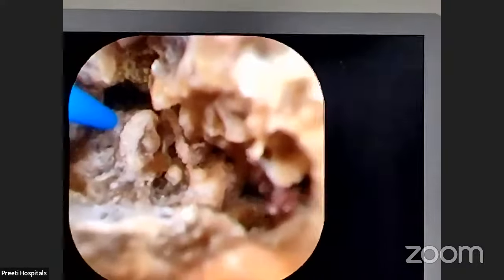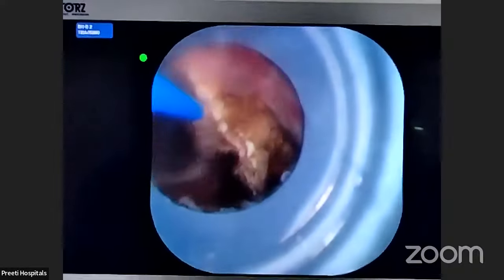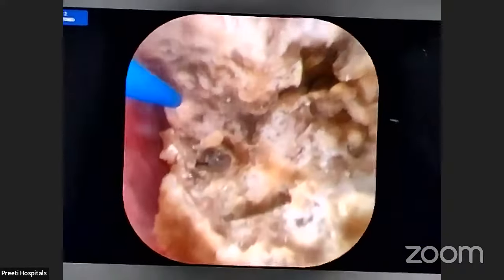Should I increase, Ramakrishna, or it's okay? 15.1 is better. See how it is sucking out. Why not to suck this? See, he is sucking out, he is flushing, and these fragments are coming out. What is the problem? Only problem is passing the access sheath into the ureter and kidney. If it is not possible, don't do it. Nobody can do it. So at the end, I will show the entire ureter. 1.5? Yeah, it is 1.5 now, thulium fiber laser, 10 watts, and fragmentation mode. This is not a dusting mode. This is a fragmentation mode.